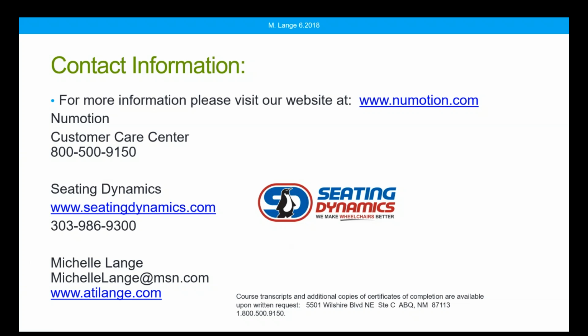So Austin has asked, what about Medicare funding for dynamic seating for someone with Huntington's disease? Have you had any success with Medicare funding? Oh boy, you know, dynamic seating is just custom made for someone with Huntington's. Huntington's is such a challenging condition where we have extremely large and forceful movements. And dynamic seating can really help absorb those forces and protect the client and keep that chair from tipping over. And sometimes that is required in combination with a pretty darn stable base. A lot of those clients use PDG bases as well.